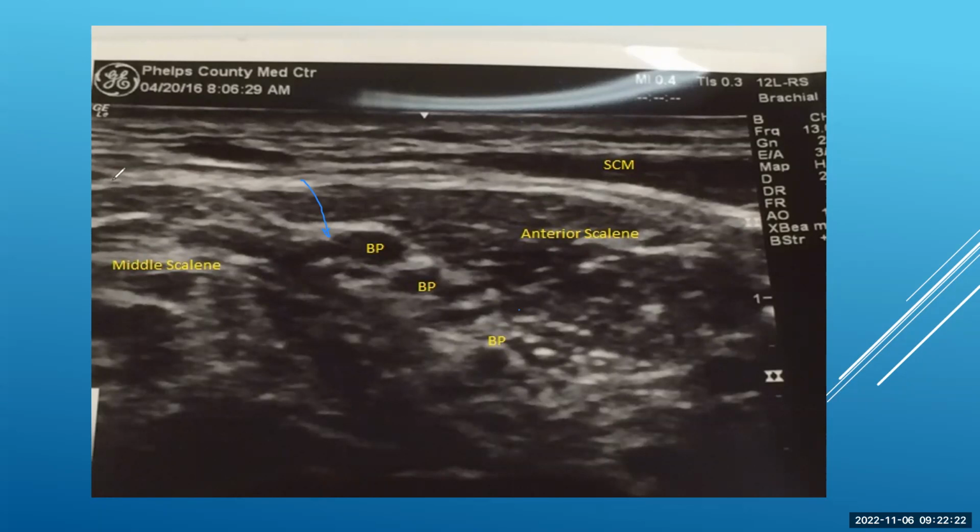Versus with the ultrasound-guided technique, again, you can survey the anatomy, see where the external jugular is going to be up in this area. It's a little compressed now. We can see the sternocleidomastoid muscle, and where the tip is, we look down and we see the brachial plexus. And so we could think this is C5, 6, and 7, if you will. And we notice that this area is really dark, and above the clavicle we do not have a well-developed epineurium and perineurium. So you're not going to have that honeycomb feature.